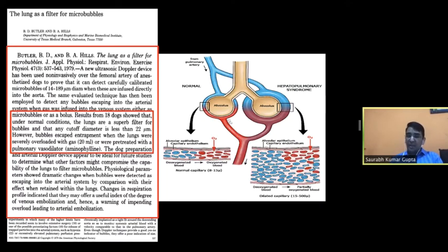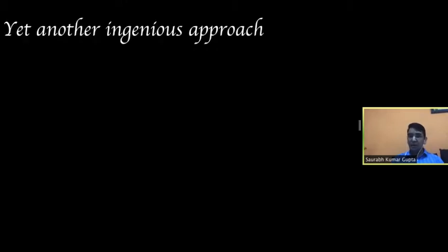Now, it became clearer how it is safe to give saline on the venous side through experiments which said initially that the lung capillaries do not pass any microbubbles bigger than 22 micrometers. Later studies showed that normal lung capillaries are 8 to 15 micrometers in size, so anything bigger than that will not be passed. So saline becomes a candidate for right heart study.